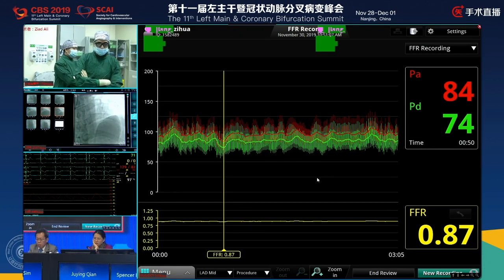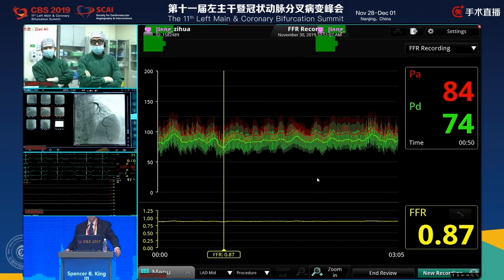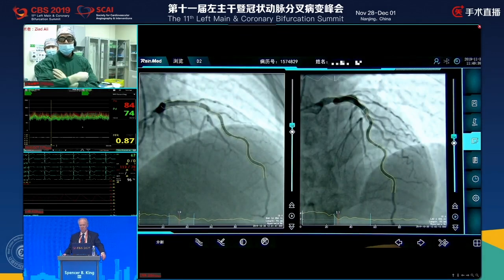All right. Sure. So can you go ahead to the camera? Can you point it towards the Angio-FFR, please? We need the camera and the Angio-FFR, please.